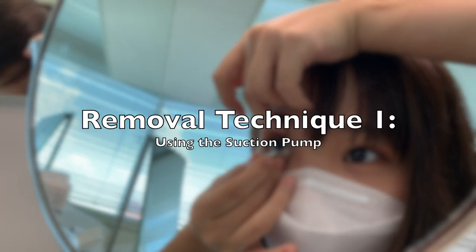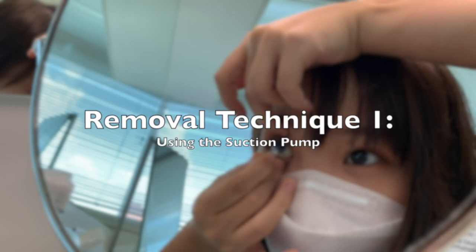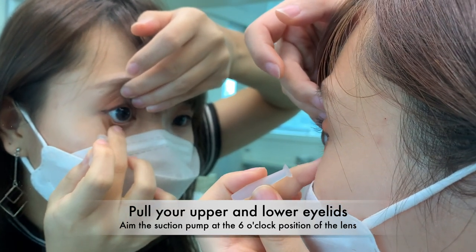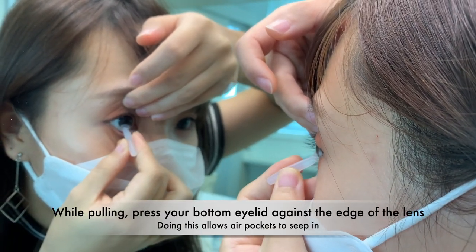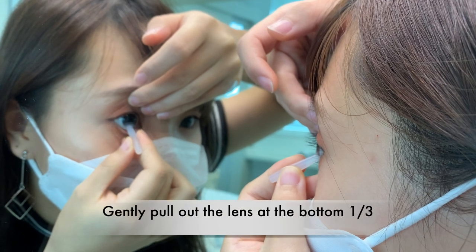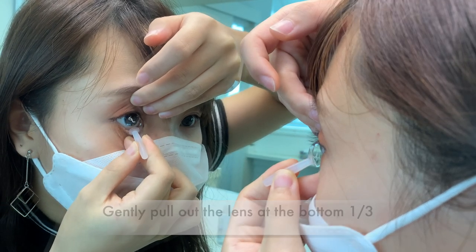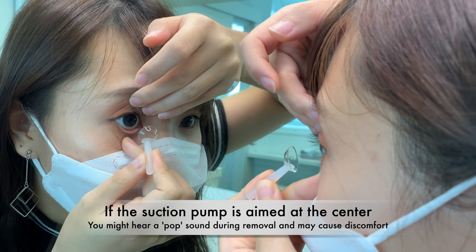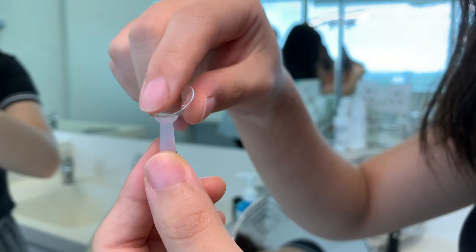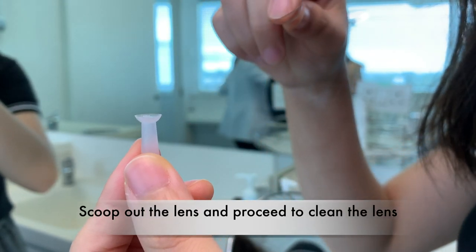There are a few methods for removing the lens. Here is one of them: pull your upper and lower eyelids and aim the suction pump at the 6 o'clock position of the lens. While pulling, press your bottom eyelid against the edge of the lens. Gently pull out the lens. If the suction pump is aimed at the center, you might hear a pop sound during removal, which may cause discomfort. Scoop out the lens and proceed to clean it.